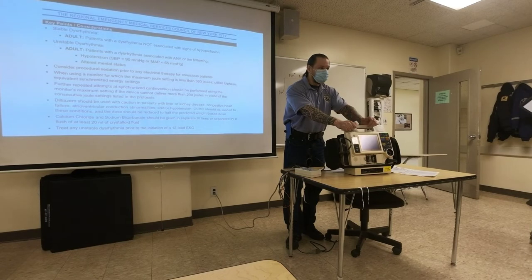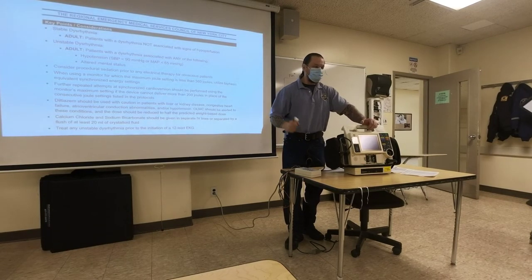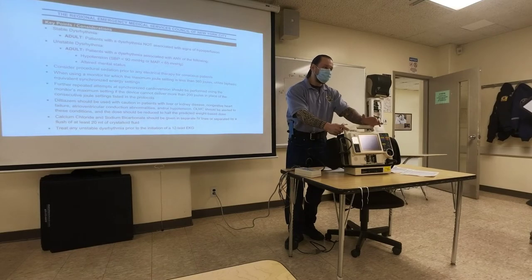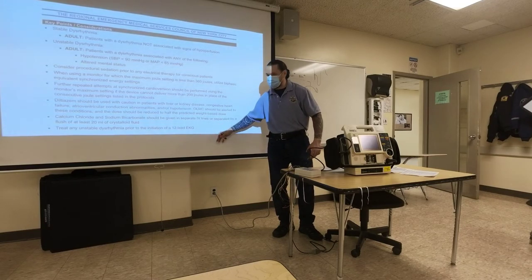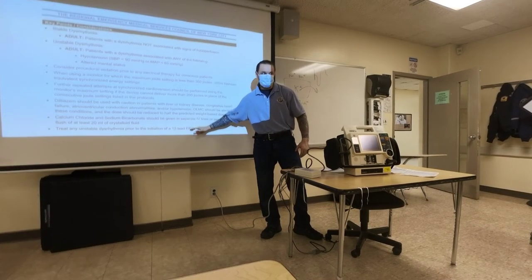A lot of times in the hospital setting, even if the person has a ventricular tachycardia or SVT or rapid AFib, they will definitely do a 12-lead just to confirm that it is in fact monomorphic or polymorphic or what the underlying rhythm is. The 12-leads are always done before treatment decisions because you don't want to make that type of mistake. In New York City, they put this there, and I think this was probably a safety feature. At some point, maybe a medic did something incorrect, so they added it here. I will say, this can kill a person. This line here.